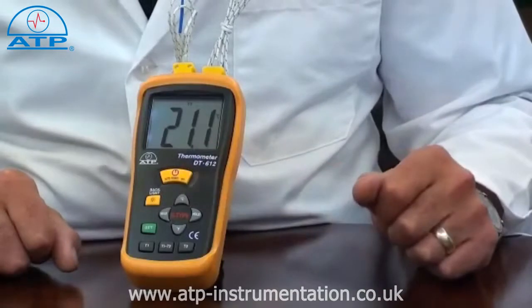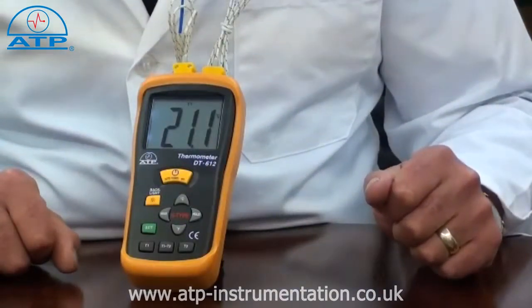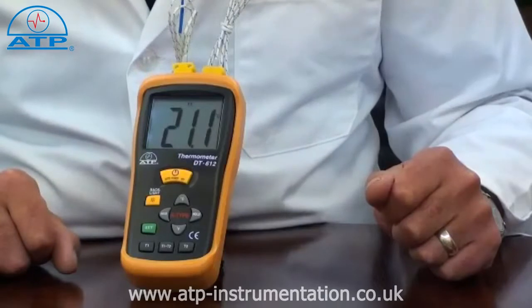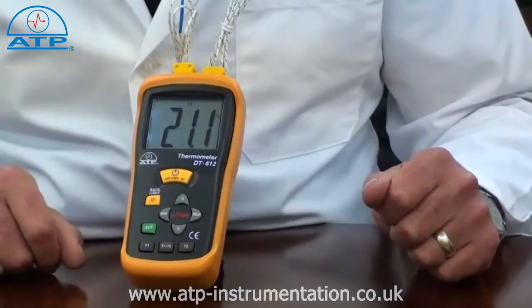Max hold is a feature that when varying temperature measurements are taken, the thermometer will display and hold the highest recorded value. It also has an auto power off function and a low battery indicator.